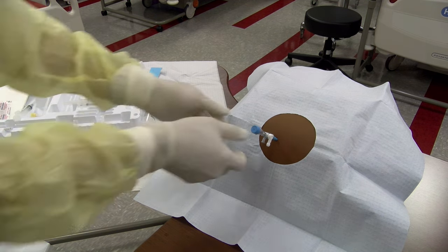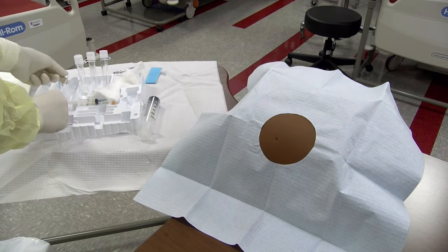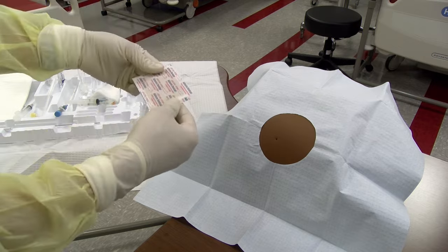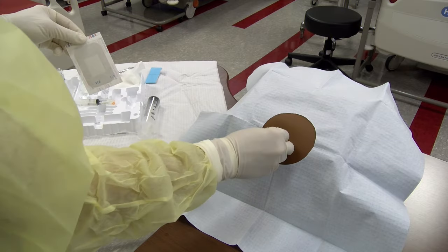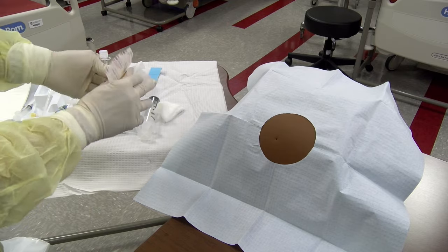Once the desired fluid has been removed, the catheter may be removed with smooth, gentle traction. Place a gauze and bandage to control local bleeding. If continued bleeding is noted, a figure-of-eight stitch may be used to close the opening of the tract.